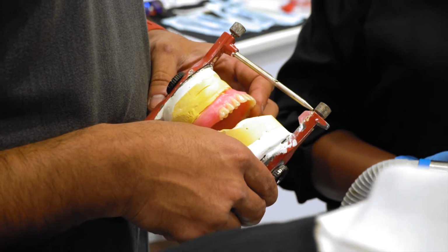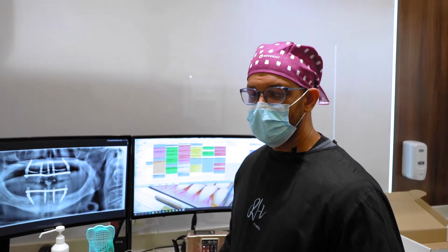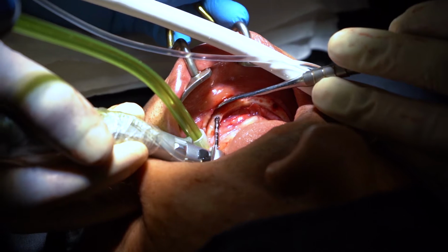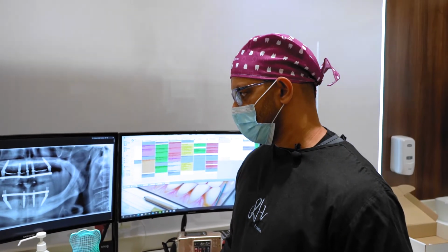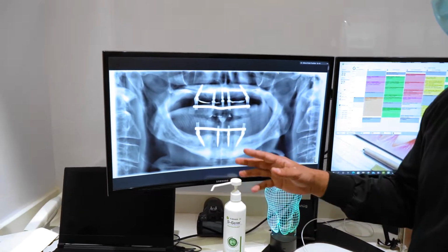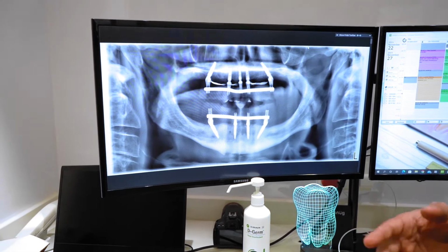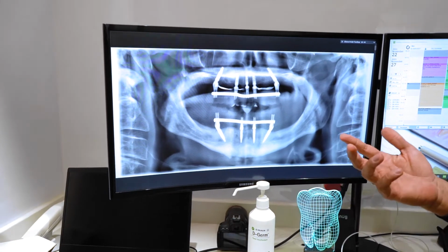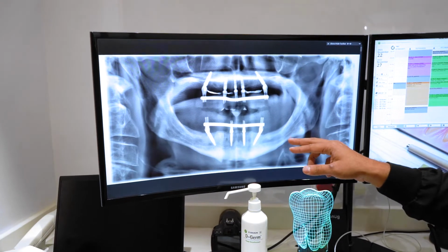So as you guys know, we're busy with a full arch case at the moment, or a neo arch case. And in simple terms, what we're doing is a patient that currently wears a full upper and lower denture, we're converting them to a fixed denture. The pan that I have up here is a classical situation of where we would hope things to be. Basically what happens is, after wearing a denture for a long time, there's bone loss that occurs naturally. Whether it's just bone loss because the teeth are not there or an ill-fitting denture, but the net result is that there's been bone loss.